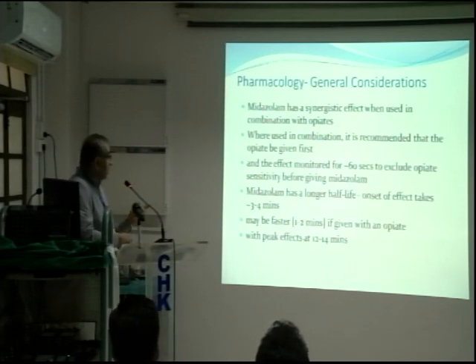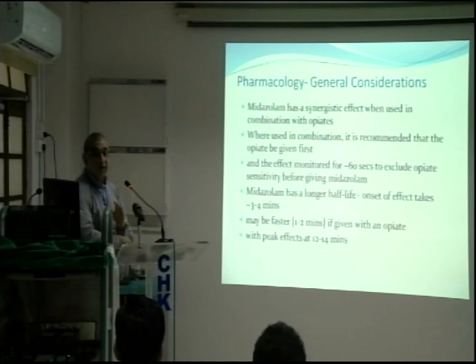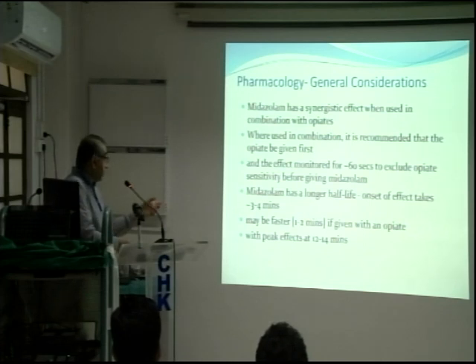The other thing is, as soon as you give the intravenous drug, we normally follow it straight with a scope. Don't do that. Give it some time, because it takes a while for it to start working. But if you give it in a combined way, the effect is much quicker.